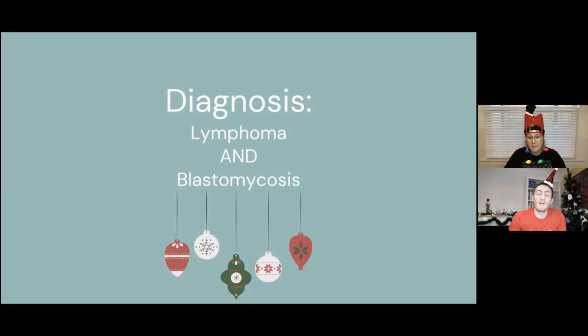So it's always a fun cytologic diagnosis to make when you find them. Also, I love infectious organisms just because they allow for an answer. Now, I will say, even though you don't see a lot of fungal infections at all, there can be a lot of overlapping characteristics in the fungal organisms. So it's not always straightforward, but here, when I see that typical snowman look, it's blasto.